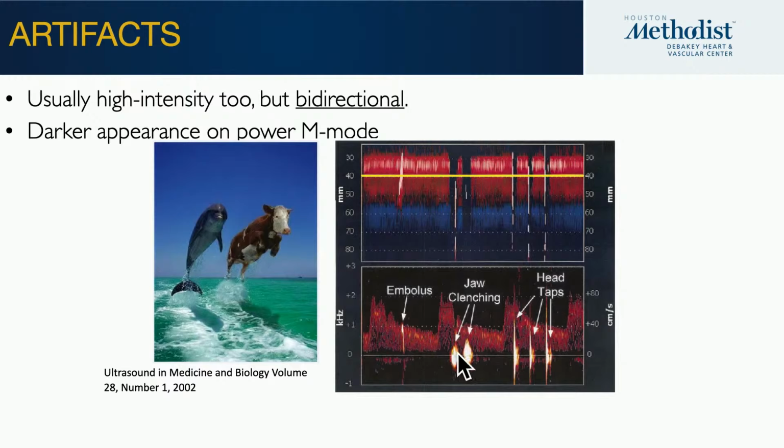So this is also Dr. Mooring's slide, and seriously, it's my favorite. When you have a jaw movement, or tapping on the probe, something that is generating a sound, I'm tapping, I've generated sound, that would have a sound signature on my ultrasound, but here with a zero speed. In a moment you have an embolus with a higher pitch, bloop, that gives you that signature, traveling in diastole. Here's your MCA signal for that.